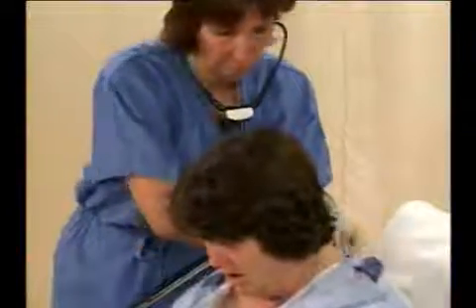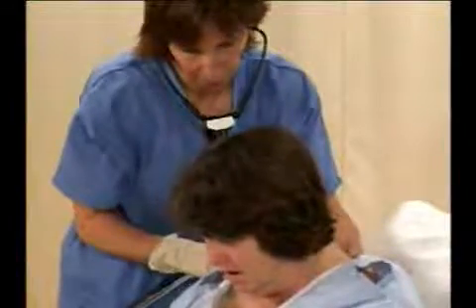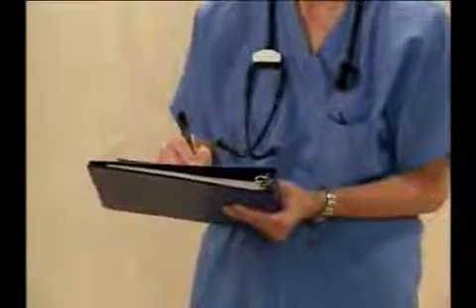Inhaler medication is delivered into the bloodstream almost immediately, and reactions can occur very quickly. Remove your gloves and wash your hands. Record the medication administration and your observations.